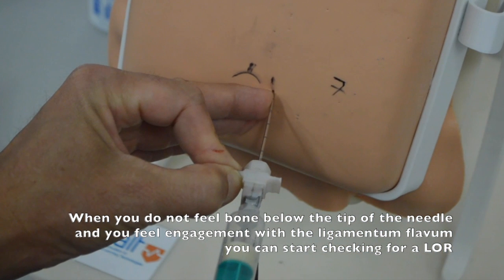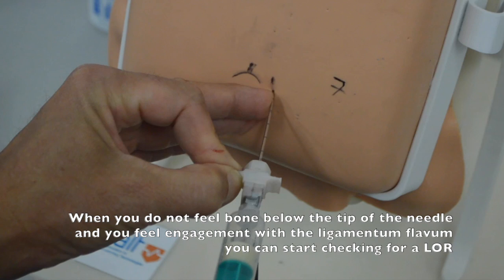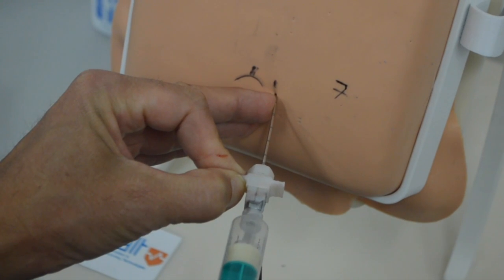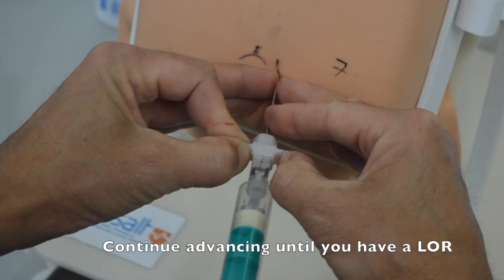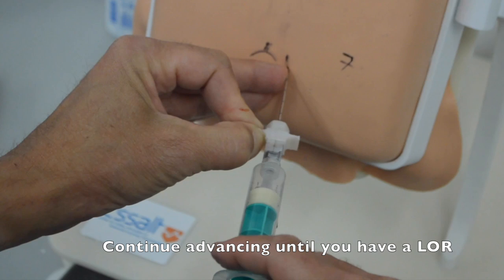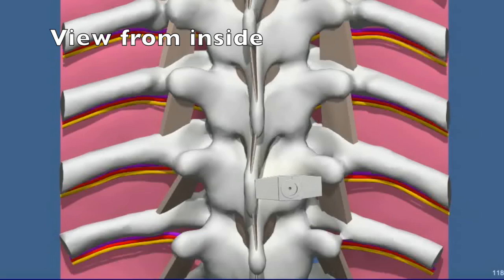When you do not feel bone below the tip of the needle and you feel engagement with the ligamentum flavum, you can start checking for a loss of resistance. Be sure to continue advancing until you have a loss of resistance. Here is a view from the inside.